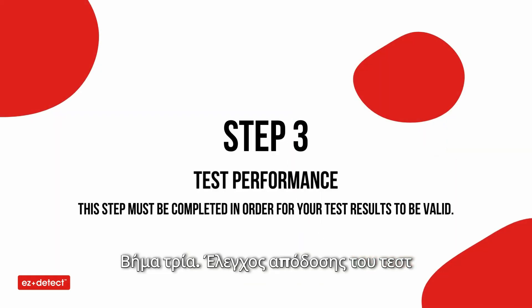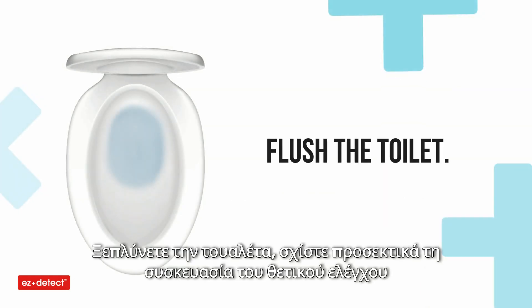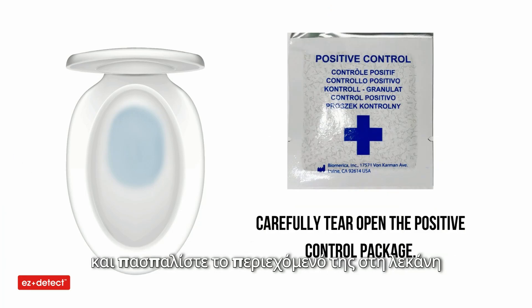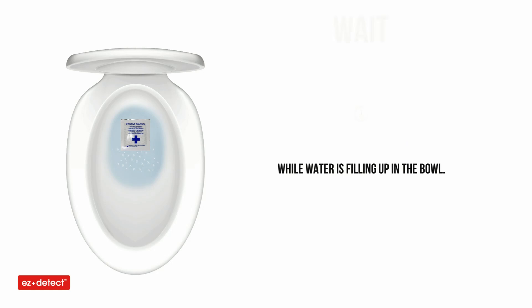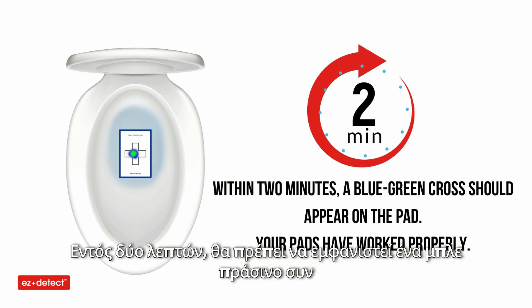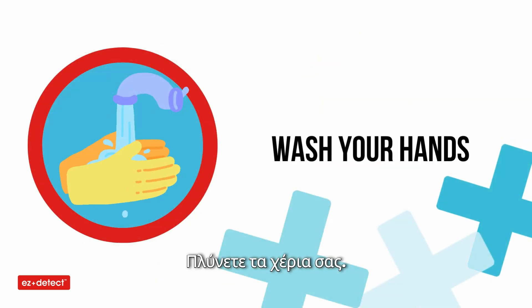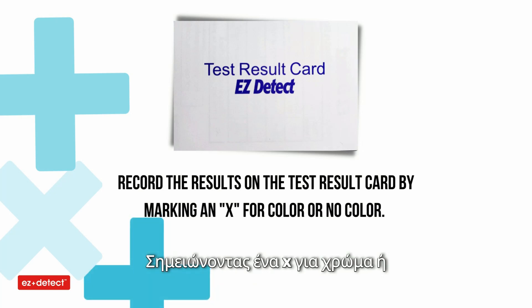Step three: test performance. This step must be completed in order for your test results to be valid. Flush the toilet. Carefully tear open the positive control package and sprinkle its contents into the bowl while the water is filling up. Wait one minute. Drop the last test pad into the toilet bowl. Within two minutes, a blue-green cross should appear on the pad, meaning your test pads have worked properly. Wash your hands. Record the results on the test result card by marking an X for color or no color.